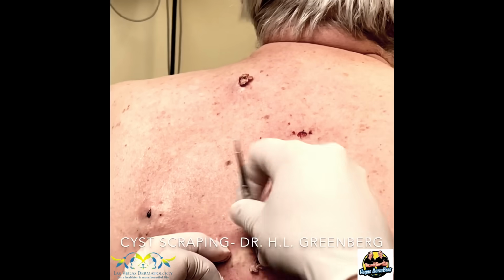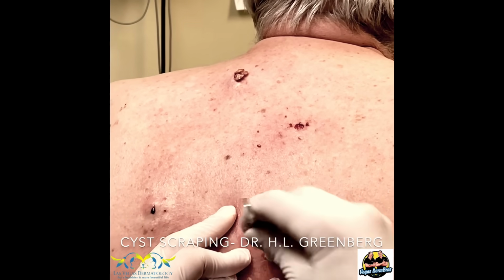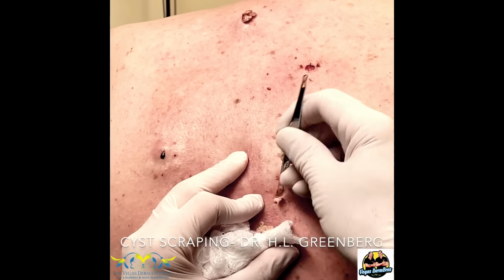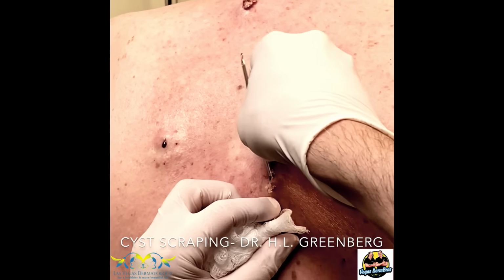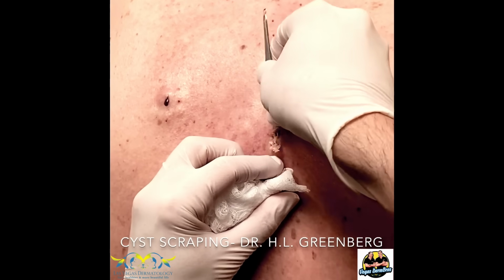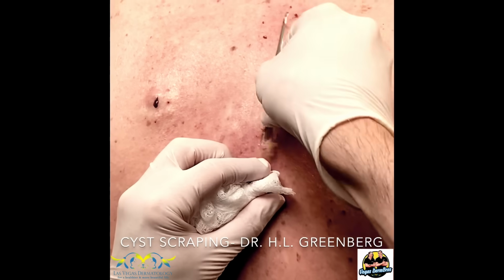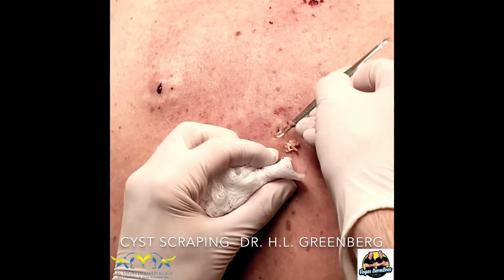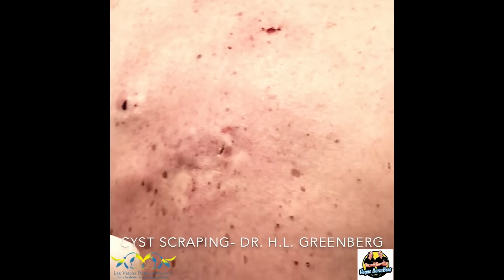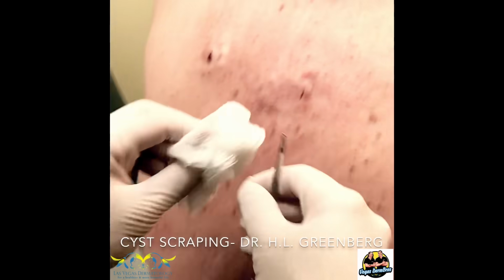No, really. This is just keratin, and it's a sac. The sac produces the keratinized contents, and we're just scraping those contents out. Ultimately, the sac will have to be removed in order to cure the condition, but you have so many of them, we'd have to schedule multiple surgeries just to remove them. So what I'm doing today is I'm clearing the sac of all its contents in all these different areas. It'll make your life better.